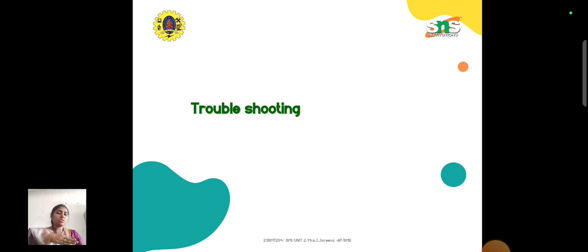This is something where we need no special technical knowledge to check the device. Any type of user, like doctors, nurses or patients, if they are buying or using an ECG machine, before using or buying it, we have to check this list. Only if everything is proper should we go to the next step.